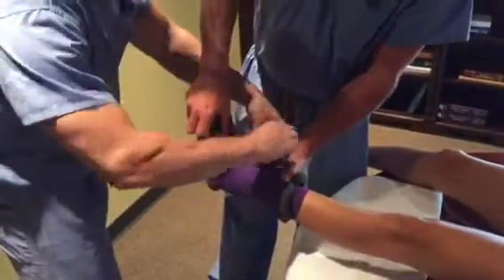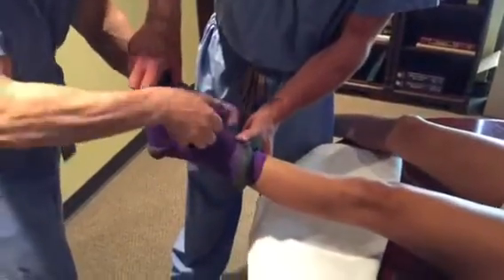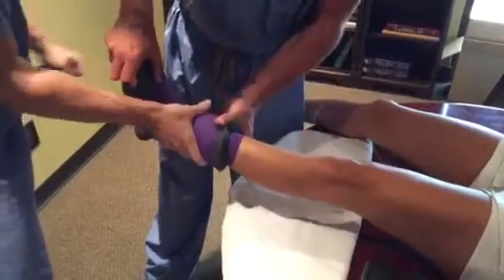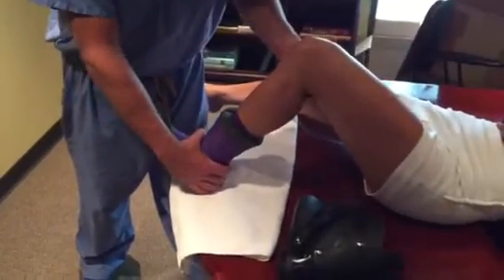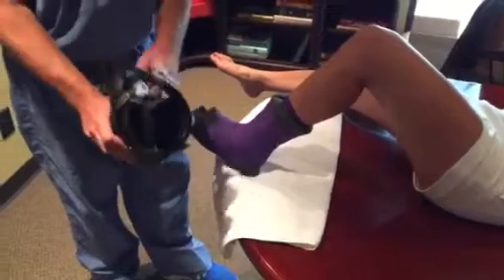This co-band helps for traction as well. Even if the foot does tend to slip, the co-band will pretty much eliminate that. So number one step in positioning for the traction boot is knee up, heel down. You'll see our simulation here — this is the traction boot.